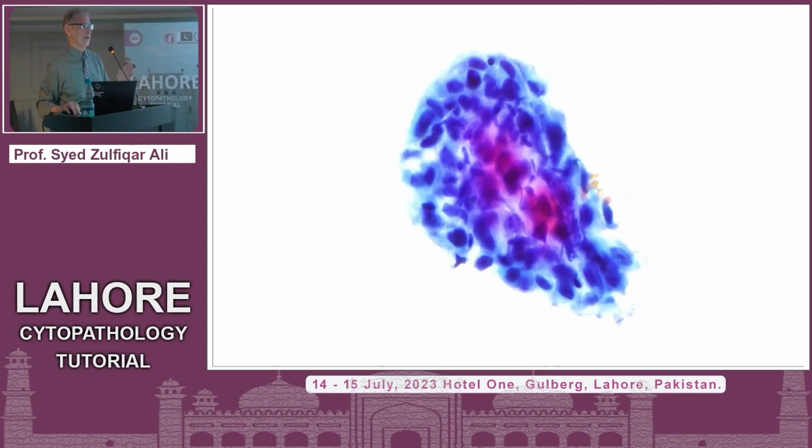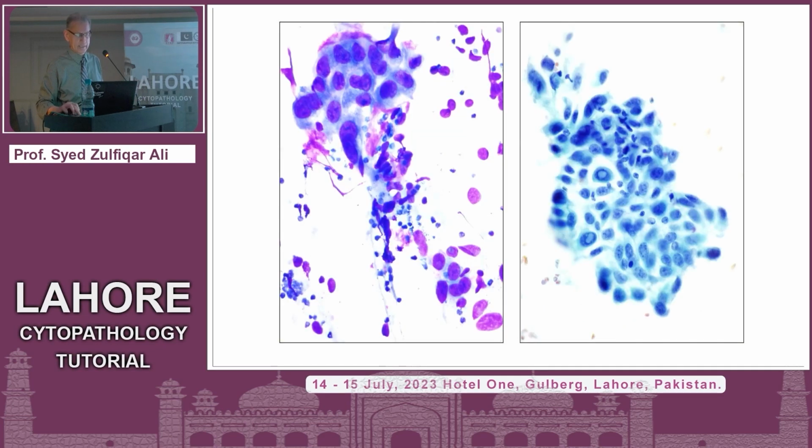Again, syncytia formations here. Cytoplasm is slightly more opaque, a little bit more polygonal look to these cells. And some cells have beautiful intranuclear inclusions, but they all are adhering together, and clearly a lymphocytic population is present in the background.